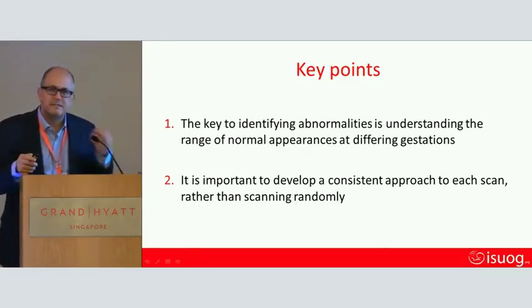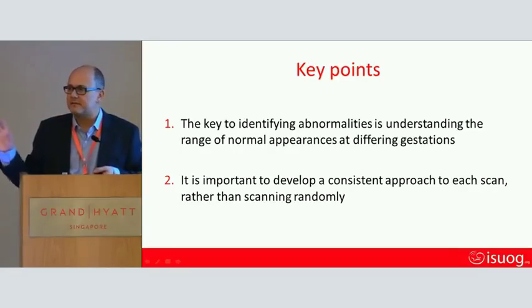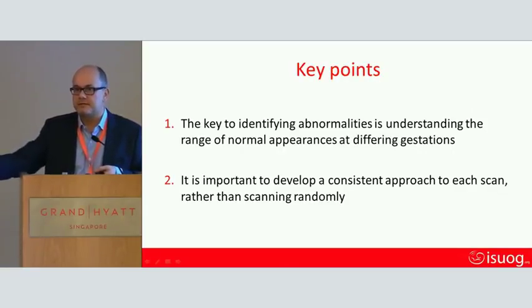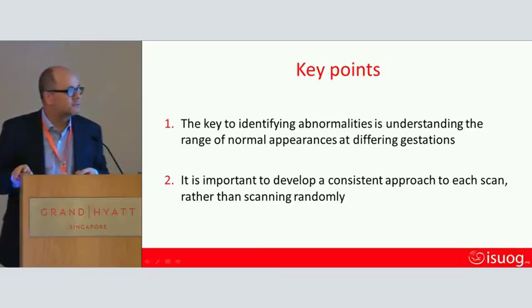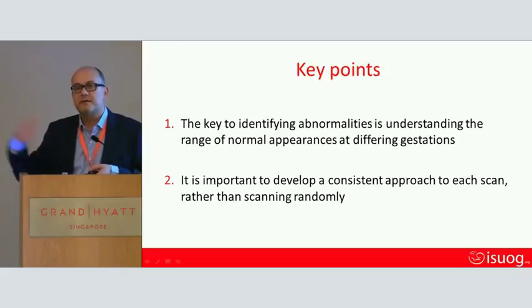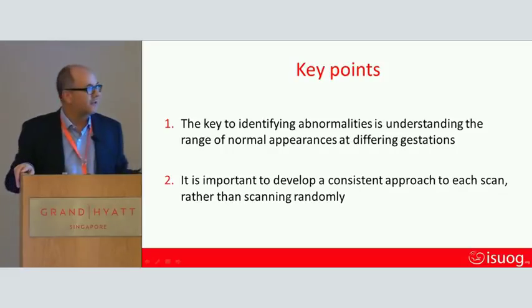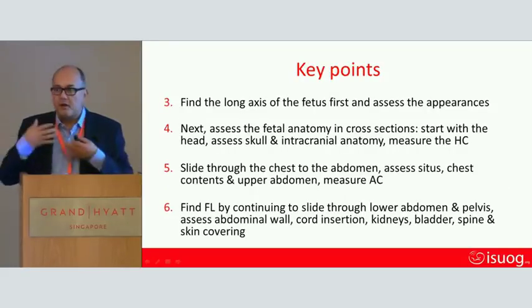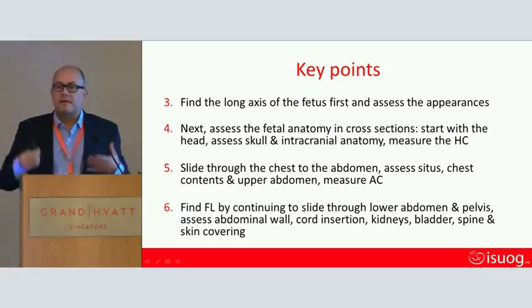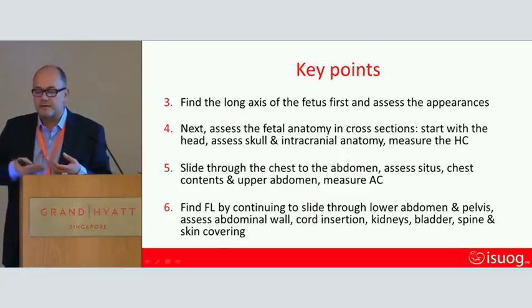It's important to have a consistent approach to scanning. No fishing is allowed. I always say to my clinical fellows, no fishing. You know what you want to see, you go and see it. Okay? So have a consistent approach. Don't scan randomly. Start in one place, know where you're going, you know where you're moving, you know where the baby's lying because you've imagined yourself lying there. Find the long axis of the baby and assess the appearances.